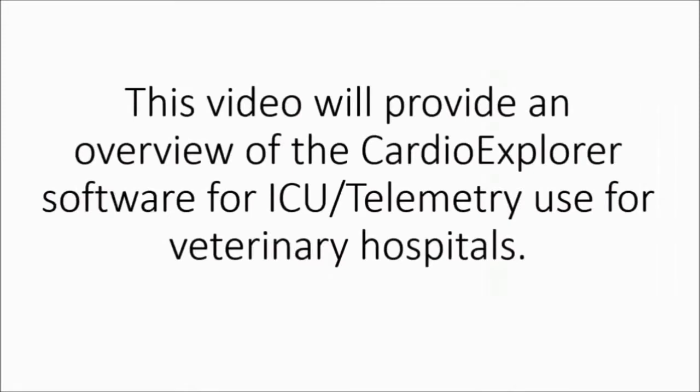This video will provide an overview of the Cardio Explorer software for ICU telemetry use for veterinary hospitals.